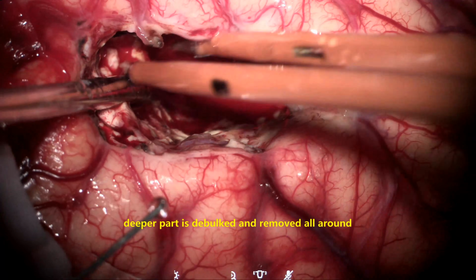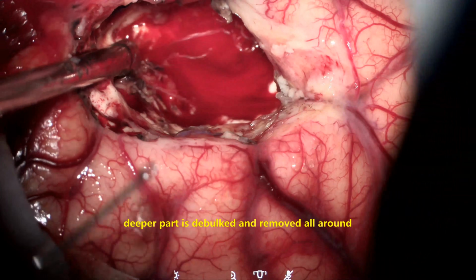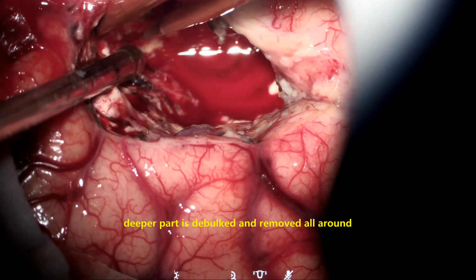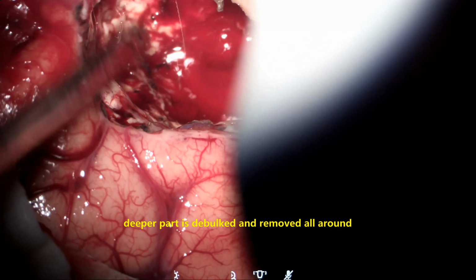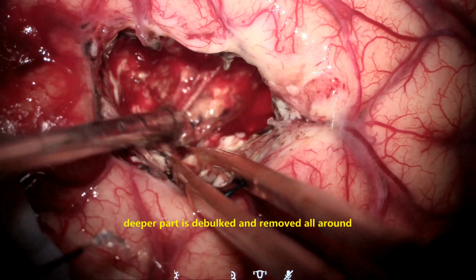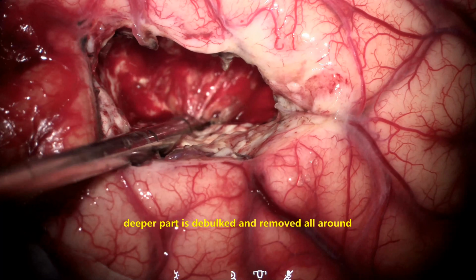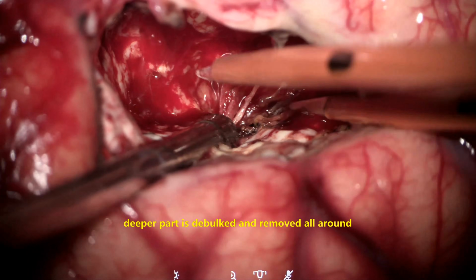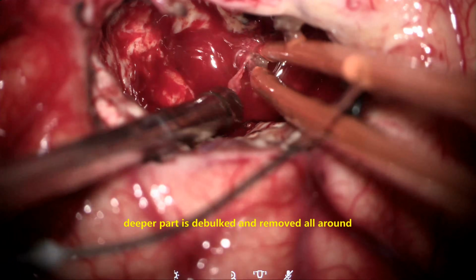Keeping the field clean helps us to prevent injury to the normal surrounding brain, vital locations like the insular cortex and frontal and temporal regions. Now we are going deeper and keep coagulating. And now you see the blood vessels coming into the deeper parts of the tumor. These are the vessels which cause bleeding in the tumor, and you keep coagulating.